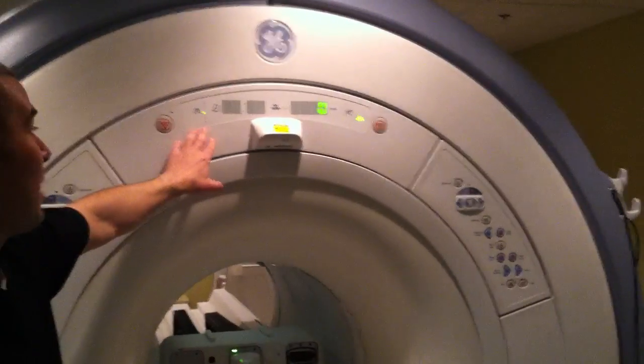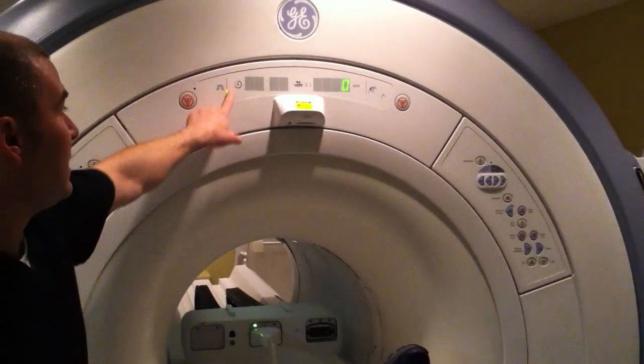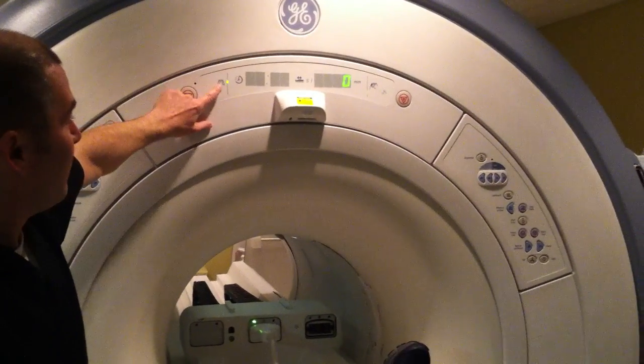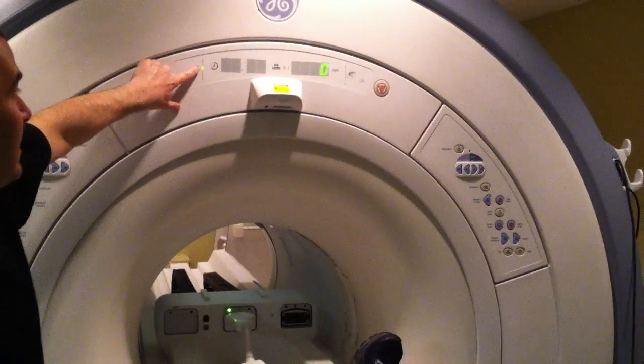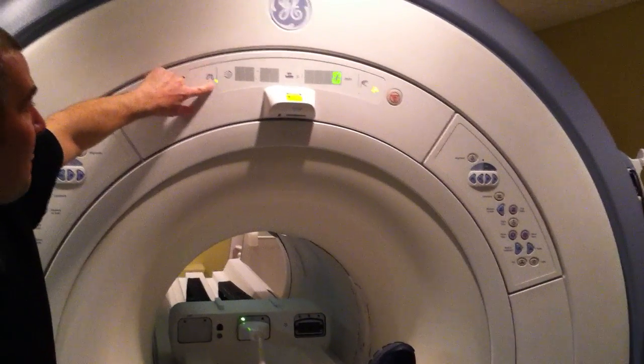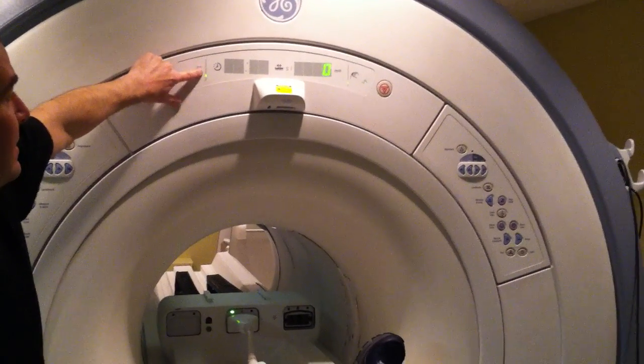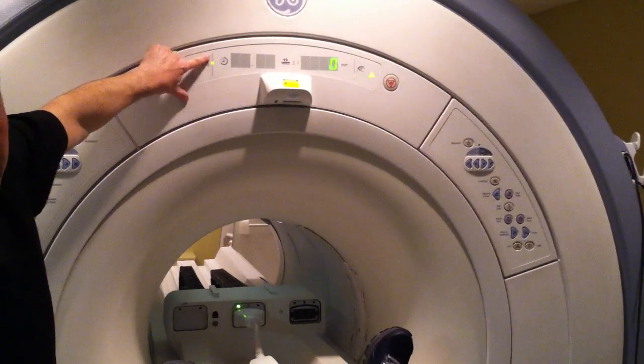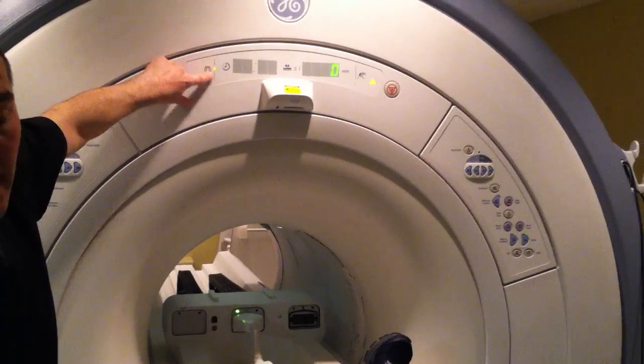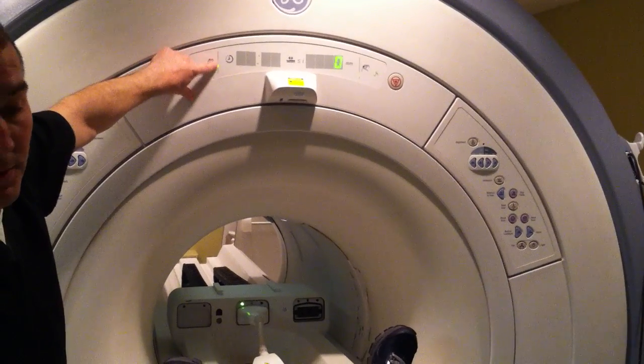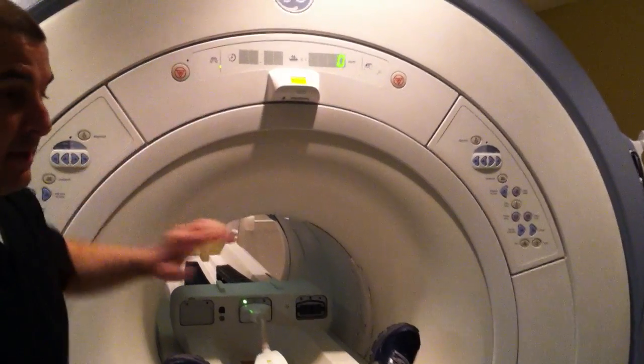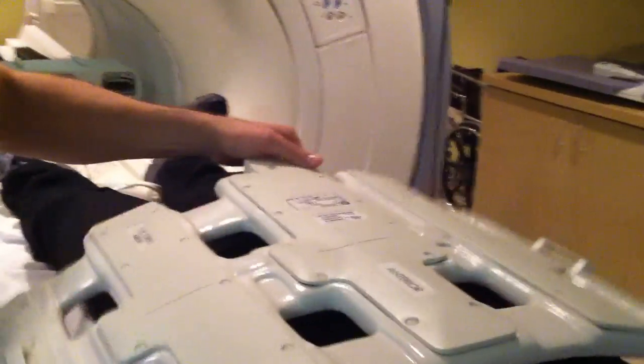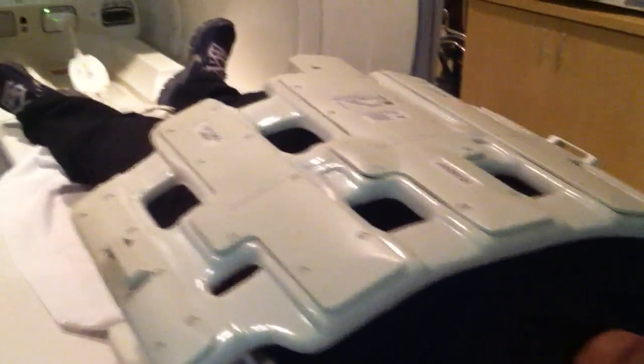And this particular model MRI, when it's done properly, you will see the picture of the lungs here. And this is the gauge to tell you if your bellows are working. If they're working okay, we want to put the coil on the patient. Here's the trick.